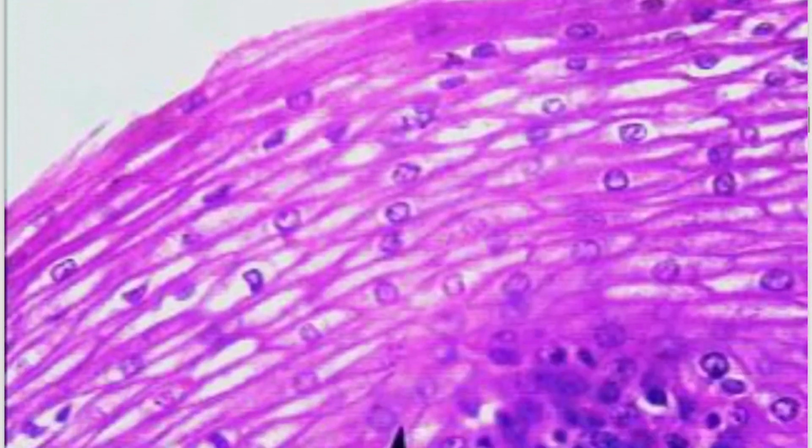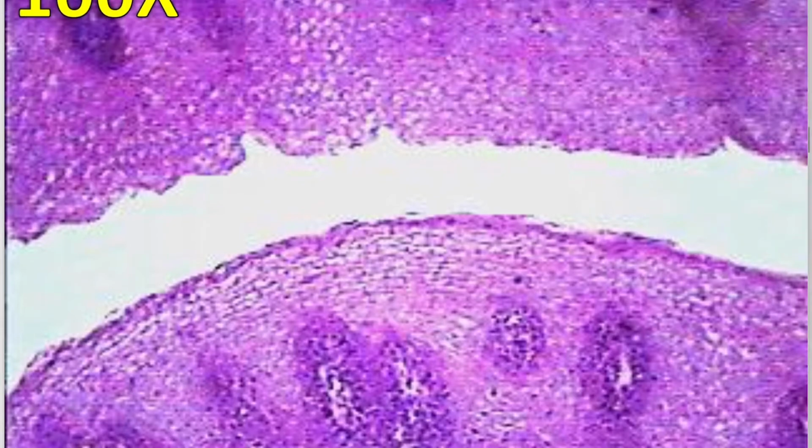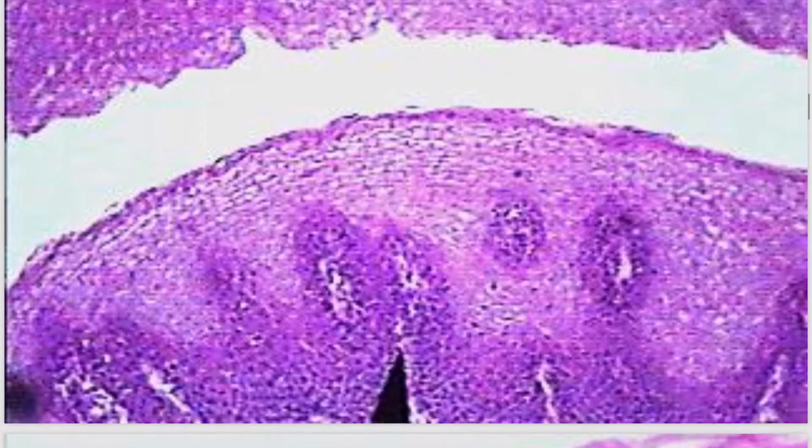Now, I think we're getting close to the end here. So we only have two left, I believe. This picture looks so bad. The amount of noise and pixelation in this picture makes it almost unusable. This is actually stratified squamous. Technically, this is your esophagus.